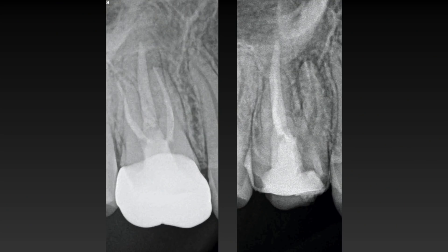As you can compare the pre-operative and mid-treatment radiograph of this case, you can clearly appreciate that the entire Gutta Percha has been removed from the meso-buccal canal without any remnants remaining. This protocol is very clear and this is the fastest, most efficient, and most economic way of removing Gutta Percha from the canal.